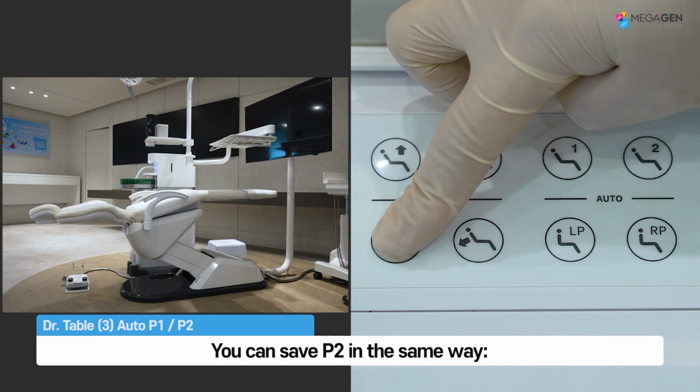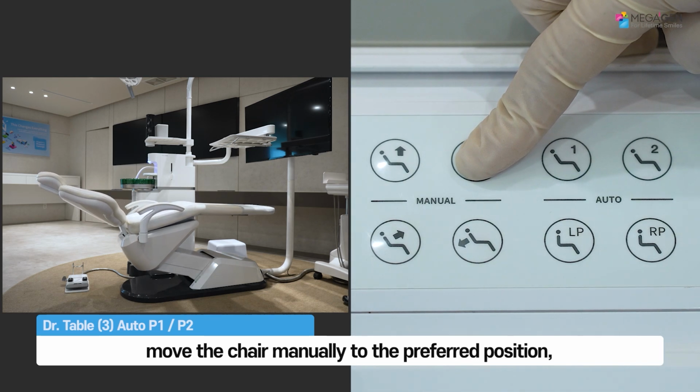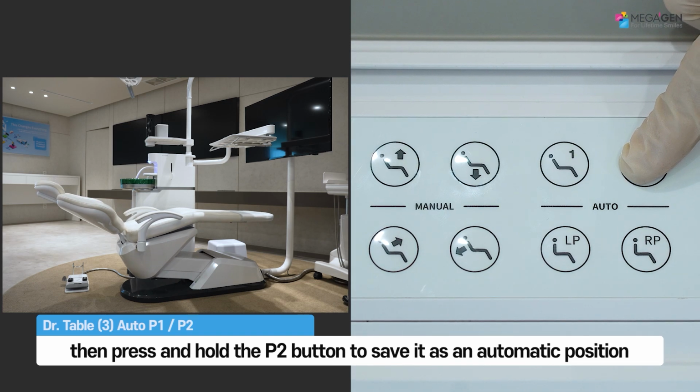You can save P2 in the same way. Move the chair manually to the preferred position, then press and hold the P2 button to save it as an automatic position.